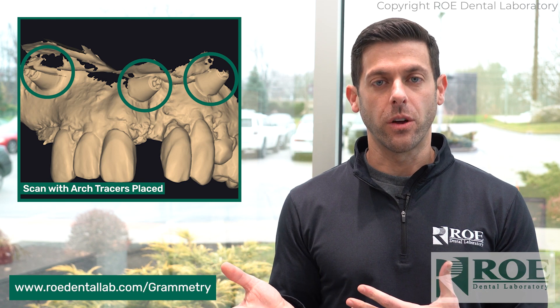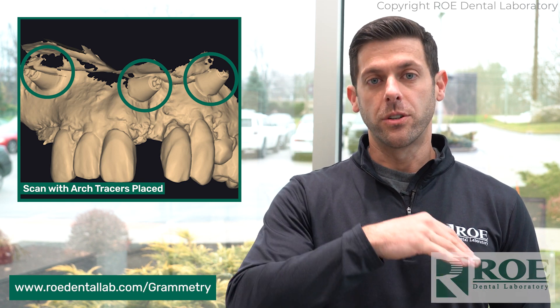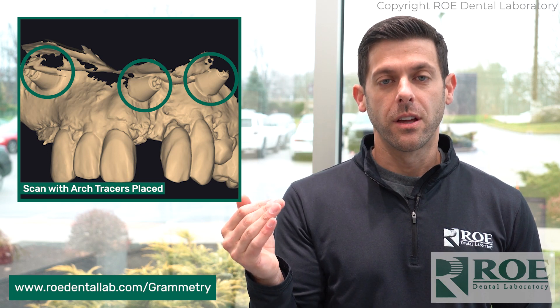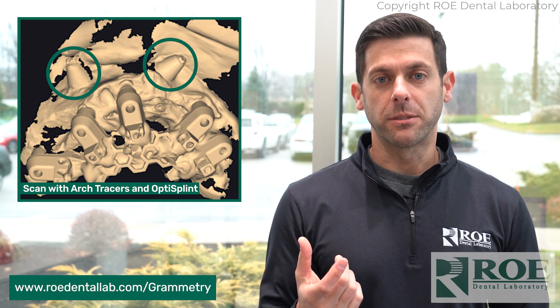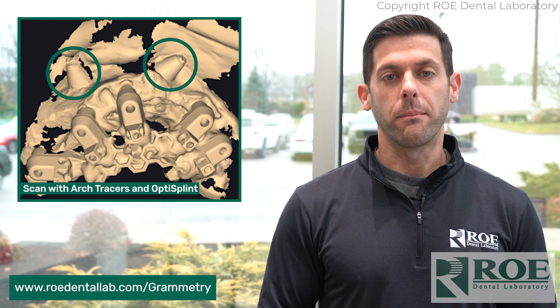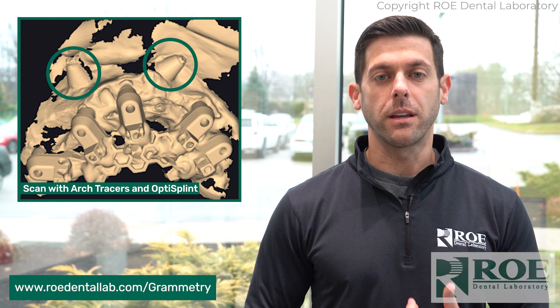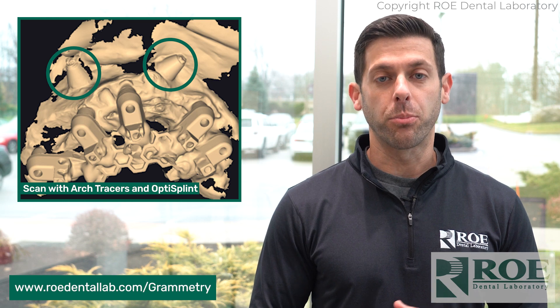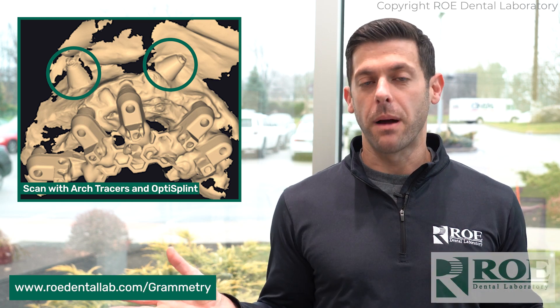There's an edentulous protocol as well you can use when doing freehand surgery. Do your pre-surgical records with freehand, then go through your surgery, insert the OptiSplint, take your scans, and do the post-scan with the edentulous protocol. Send that to us and we'll make you a nice design for your immediate load prosthesis — direct to multi-unit abutments. The best part is it's accurate, and all you need is your intraoral scanner.